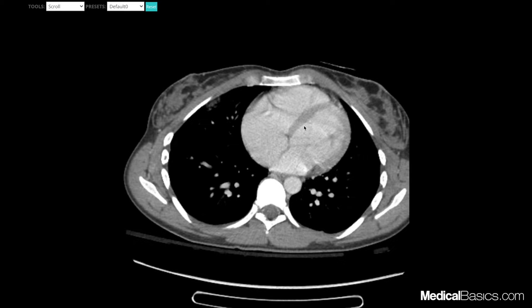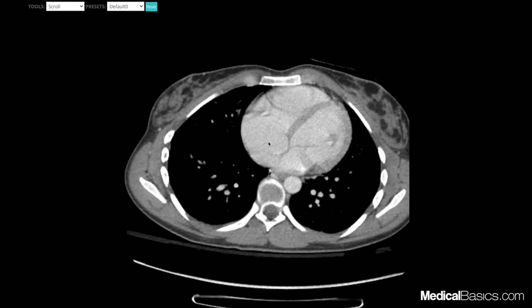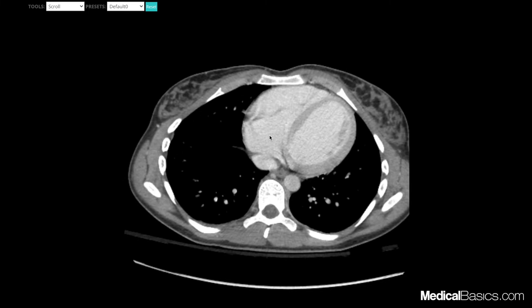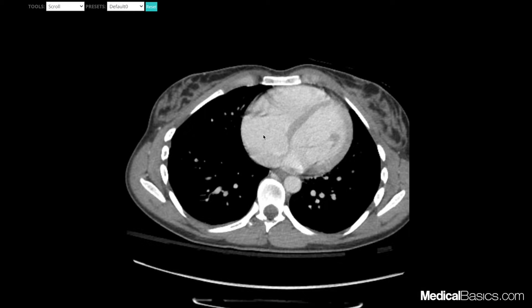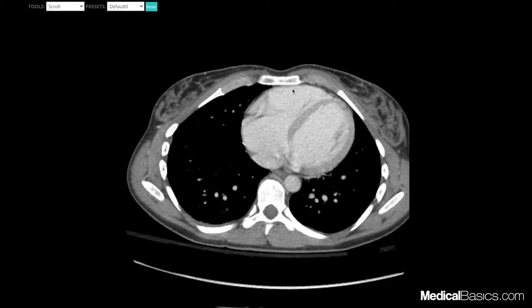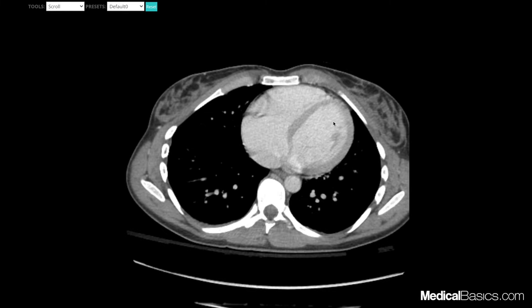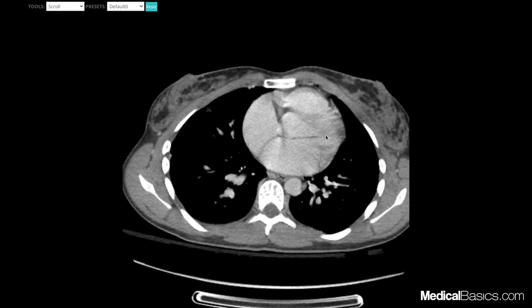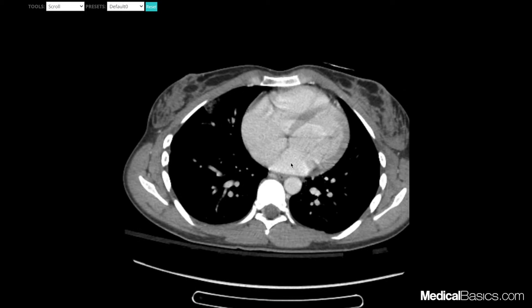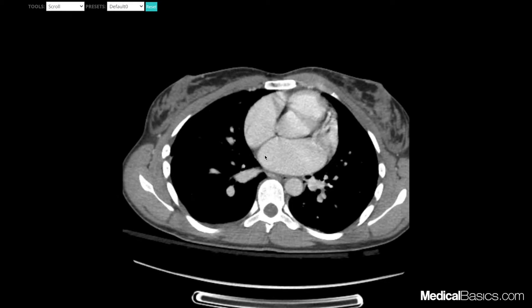The first thing is going over the major structures in the mediastinum, the main one being your heart. This is going to be our right atrium, this is going to be our right ventricle, our interventricular septum, this is going to be our left ventricle, and this is going to be our left atrium.